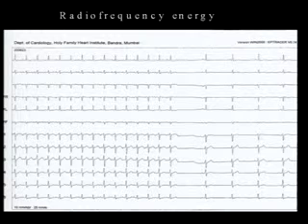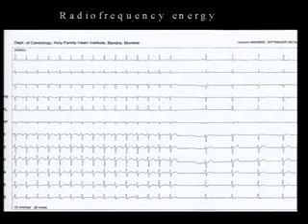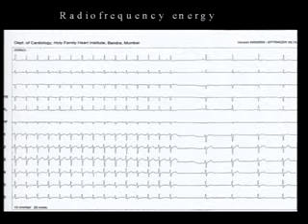So, no, based on the ECG you couldn't, but if you did a 24-hour Holter, you don't get incessant inappropriate sinus tachycardia. Dr. Green, what do you think? I totally agree. I think if you do a 24-hour Holter on the person who has inappropriate sinus tachycardia, you see substantial variation at nighttime during sleep, including heart rates that come down to 60 and 65. So yeah, though it's very different, it's not incessant.